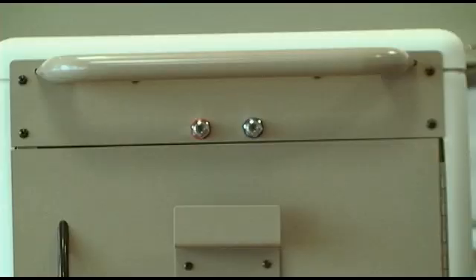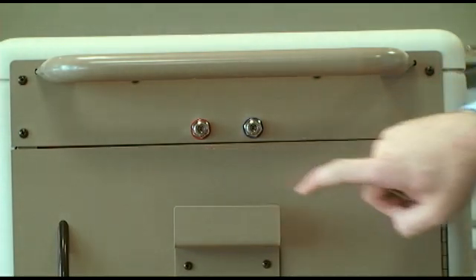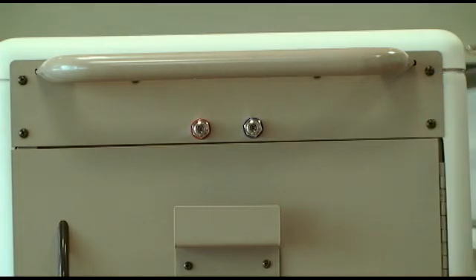Quick connects are located on the back panel below the handrail. The air quick connect is red and the water quick connect is blue. You can attach accessories to utilize the 100 psi air available from the VetPro. Accessories that require a lower air pressure will need a regulator.